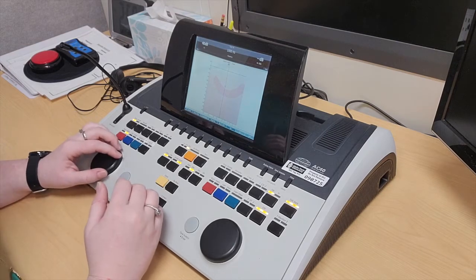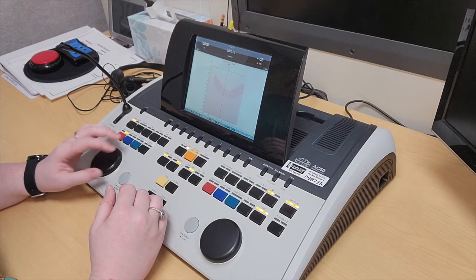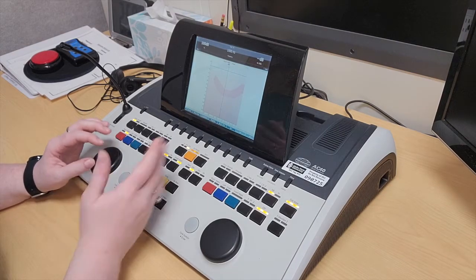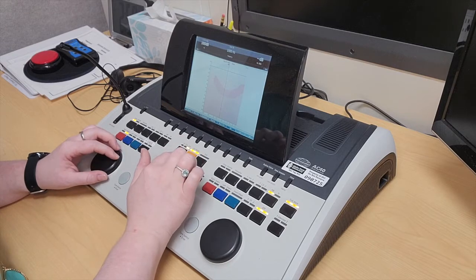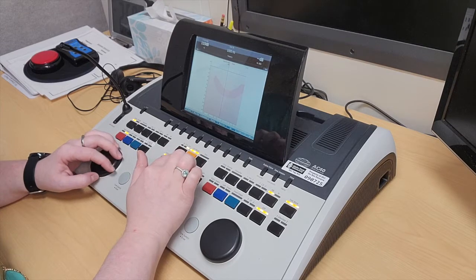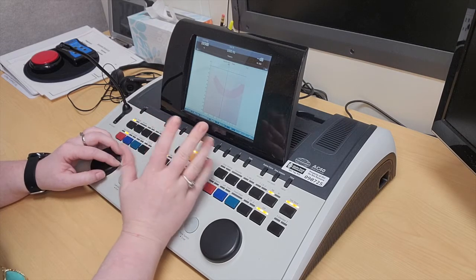If I wanted to go to extended range, this only goes so high, but if I wanted to go higher than 100 dB, I would click the extended range and then I can go higher.